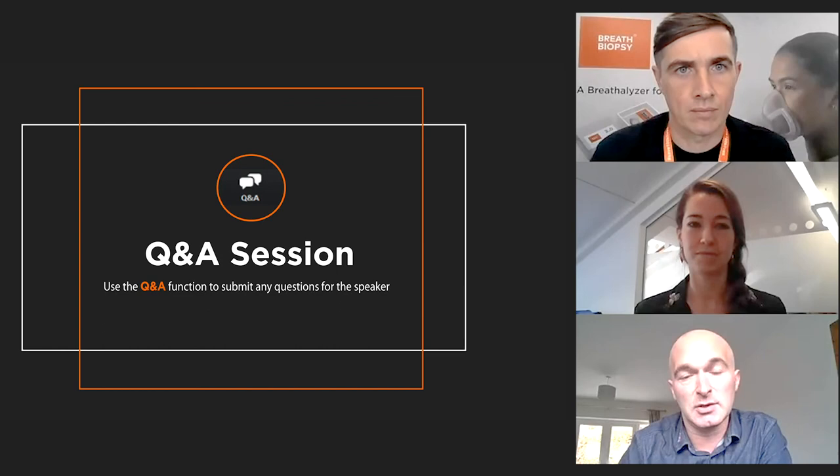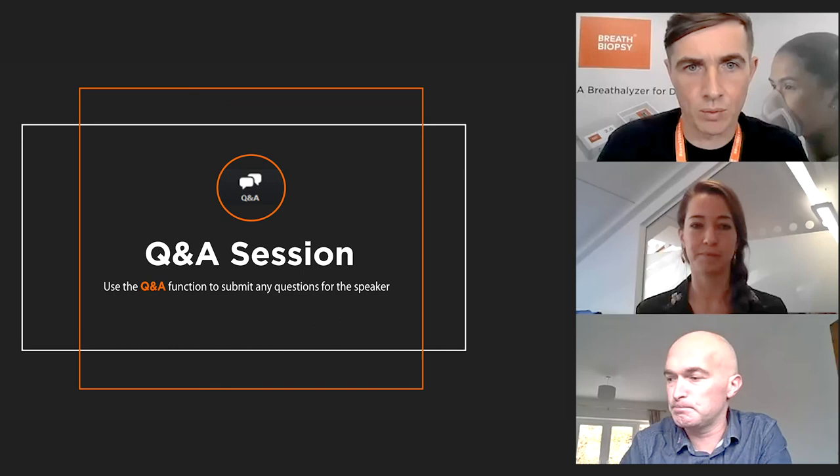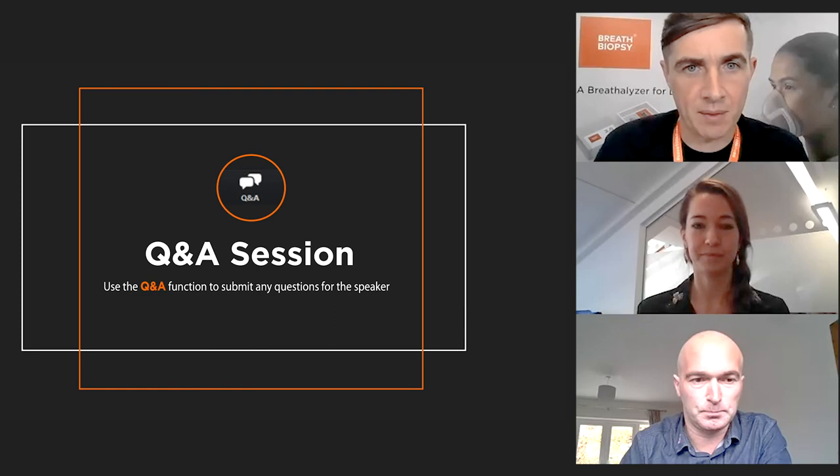Brilliant, thank you. I think we've got time for just one question. So it's a fast one. Is the breath sampler reusable? Yes is the answer to that.